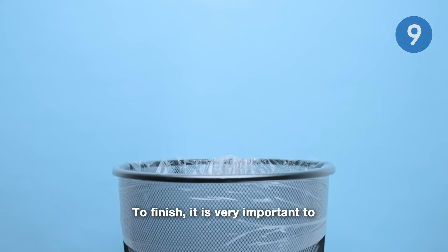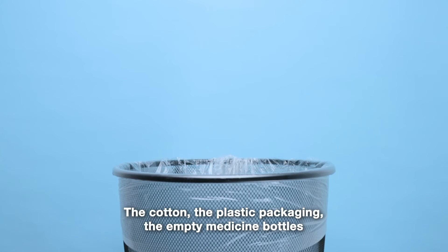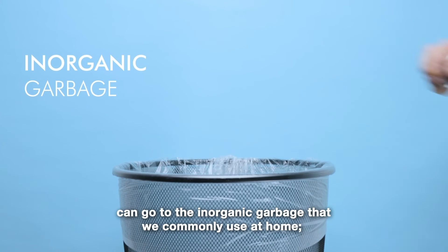To finish, it is very important to dispose of what we have used in the correct way. The cotton, the plastic packaging, the empty medicine bottles, and the syringe without the needle can go to the inorganic garbage that we commonly use at home.